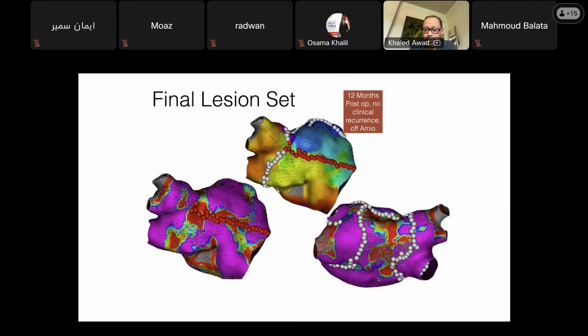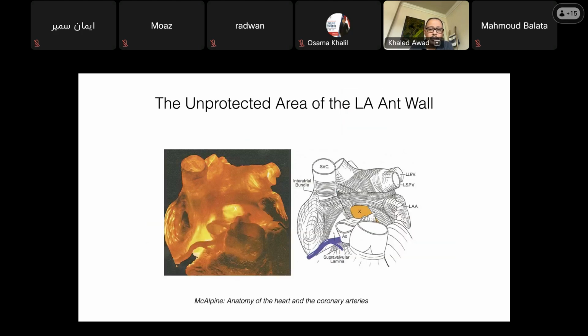Today in the EP lab, I would have isolated the posterior wall. The patient did well and didn't have any other flutters. We did address the roof because of the scar that was evident on the left atrial roof as well. In the PFA world, I would have also isolated this posterior wall. Even if it were RF, I would have isolated the posterior wall because of that voltage abnormality here. We talked about that concept before.